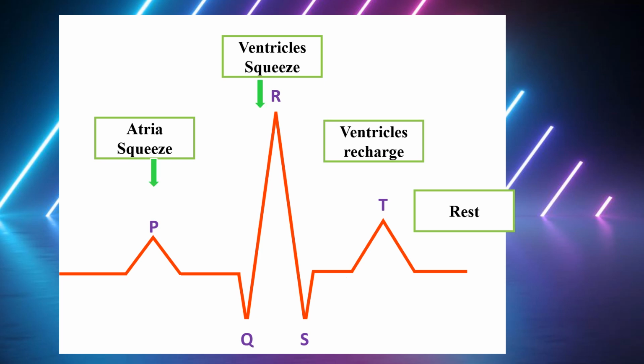Atria squeeze, ventricle recharge. Pause. Now, the atria actually repolarize during the QRS complex, but for the purposes of this, we're going to consider the P wave as the atria squeezing, the QRS complex, the ventricle squeezing, the T wave is the ventricle recharging, and then a period of rest where the heart's refilling.